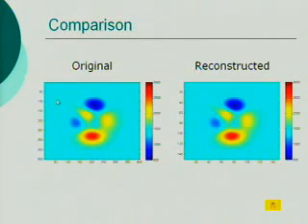And here is the comparison between the original one and the reconstructed one. As you can see, the only difference is the resolution. So in order to increase the resolution, you need to increase the number of transmitter-receiver sites.